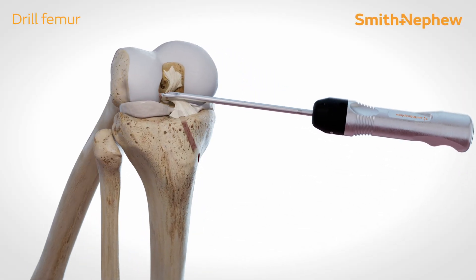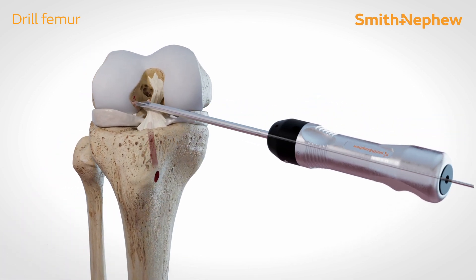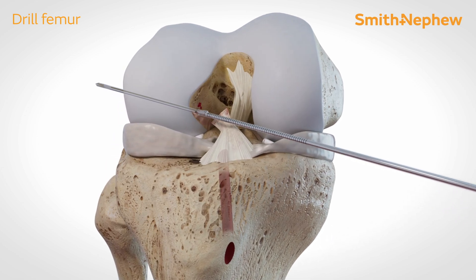Insert the 0 mm femoral offset aimer through the portal, then drill a 2.4 mm guide wire into the femoral footprint. Drill over the guide wire with a 4.5 mm endo button drill bit.